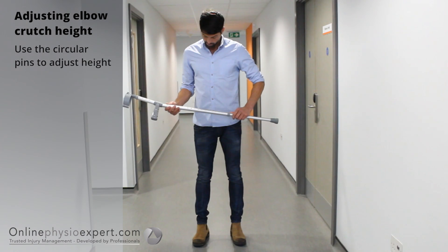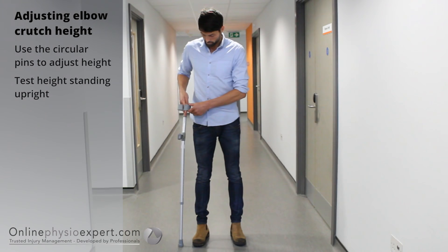Before using an elbow crutch you may need to adjust it to the correct height. The top of the crutch handle should lie just below your wrist crease line.